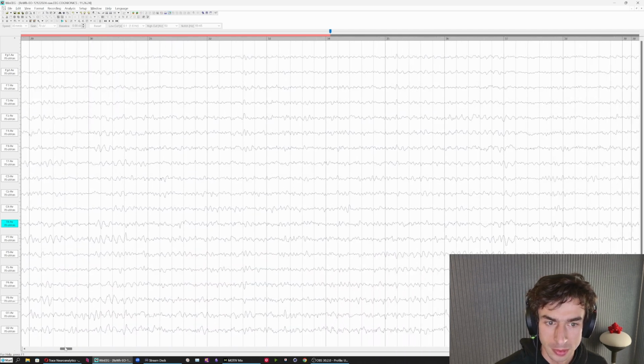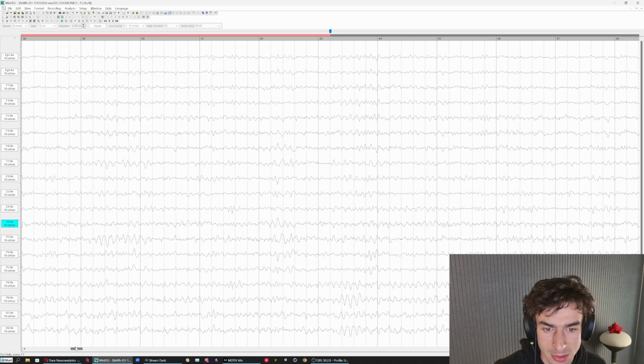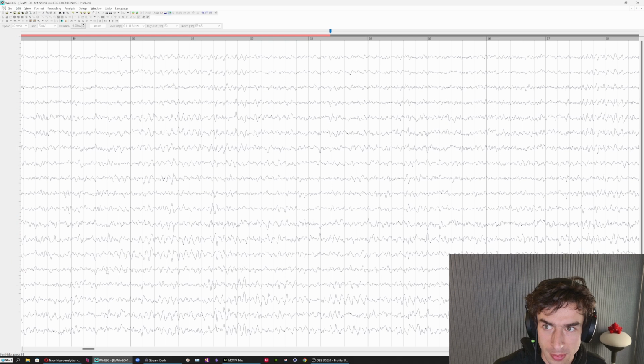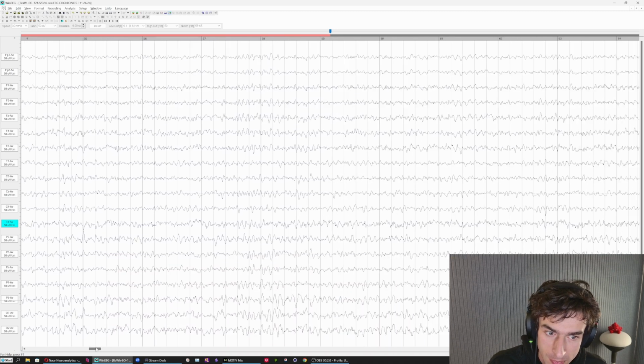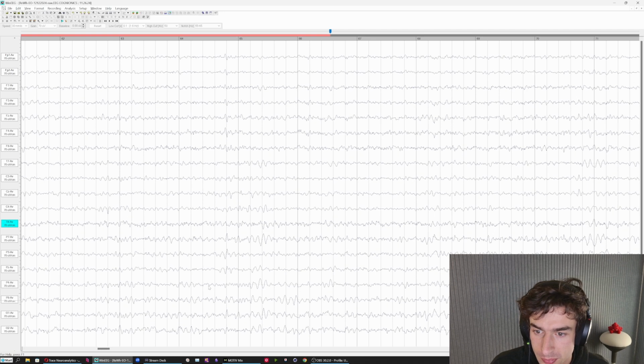Right, and nothing really jumped out at us when we were scrolling through it the first time, but the second time is an opportunity to go through with a little bit of a closer eye now that we've gotten rid of the non-cortical activity, or at least most of it.